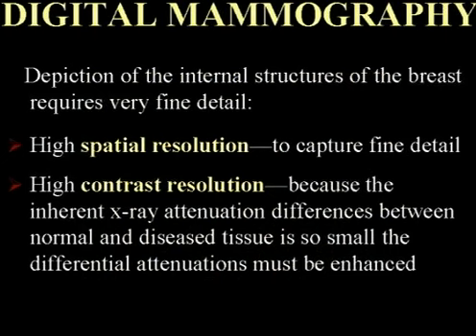Well, as we look at the different vendors and we try to assess whether switching to digital is of value for us and how we will pick amongst the various manufacturers, we have to consider a couple of things. Certainly, everyone understands that we need high-resolution images. But what is high resolution? Well, it really has two different components. There is spatial resolution, which I think we're all familiar with, but there's also contrast resolution.